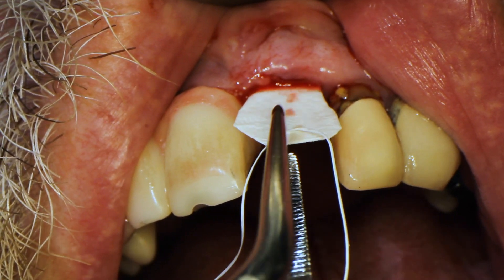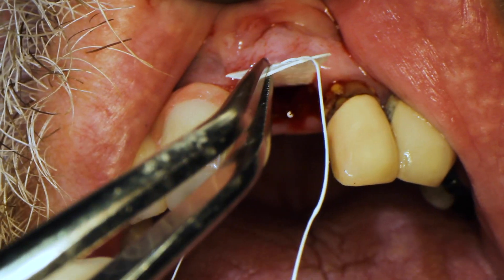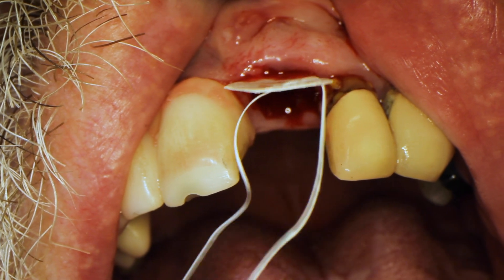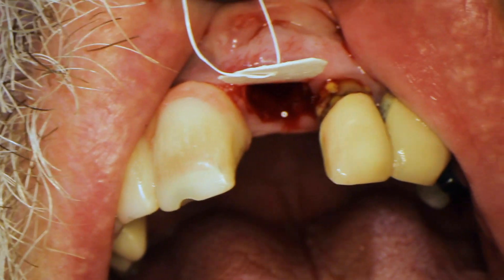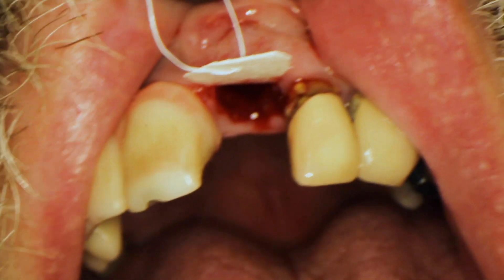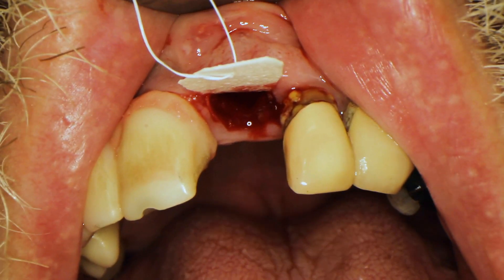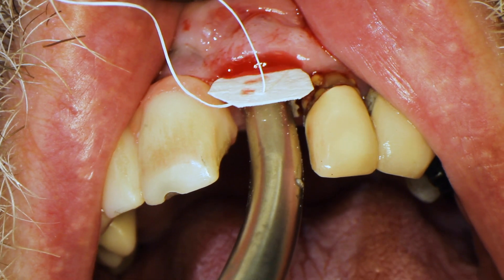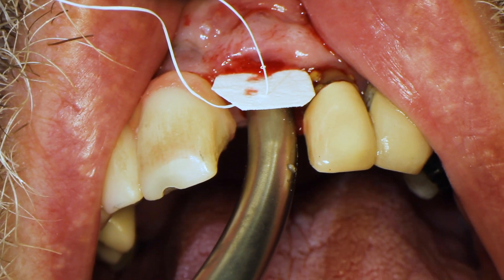I try the membrane in and make sure it's the right shape. If it's too big, I'll pull it out and trim it a bit more. If it's the right size, I make sure the tip of the ice cream cone goes all the way down to the socket, past the dehiscence.